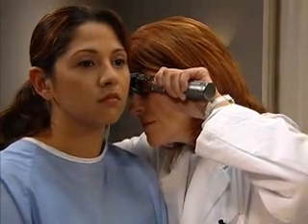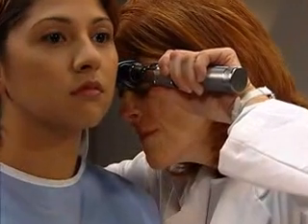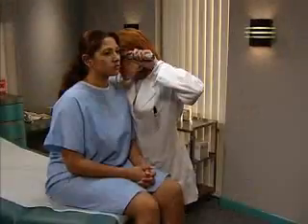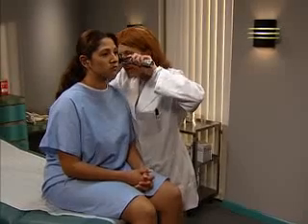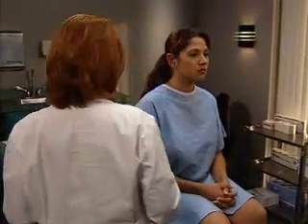Inspect the auditory canal, which should be pink with hairs in the outer third, but no lesions, discharge, or foreign bodies. You may see a little cerumen, which can vary in color and texture, but should be odorless.